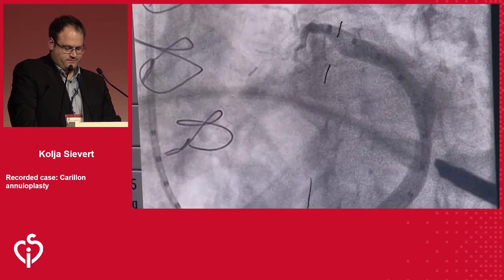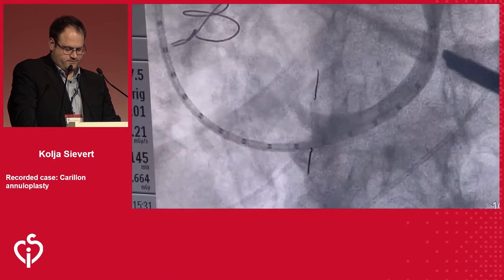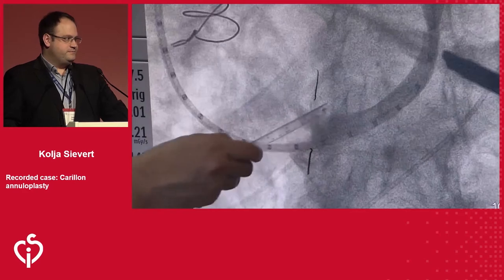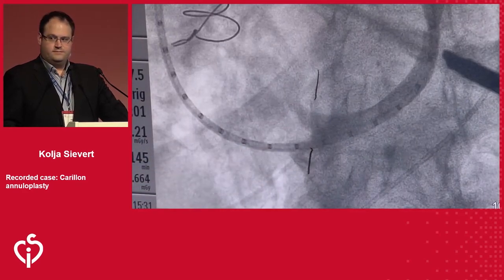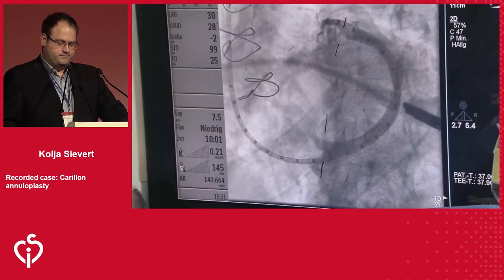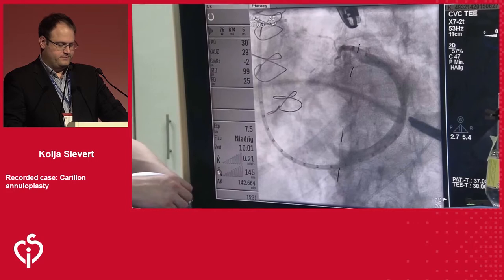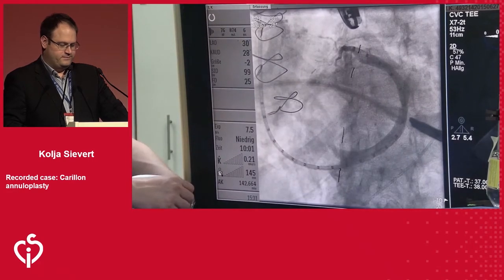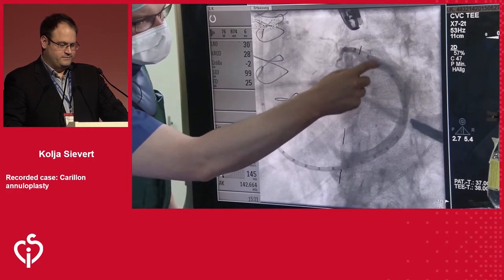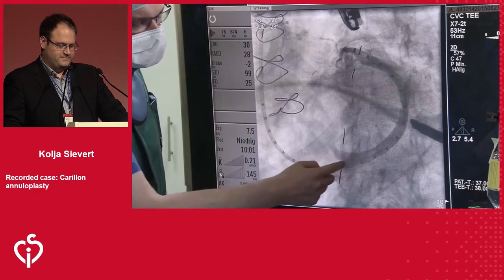And then for the proximal segment where we'd like to place our proximal anchor, I'm getting an average diameter across this 2-centimeter length of about 9 millimeters. Mm-hmm. So we have a sizing chart that indicates which device we should select. And the sizing chart is telling me that we should have a 12 by 18. So we'll have a 12-millimeter distal anchor right here, and we'll have an 18-millimeter proximal anchor right here.